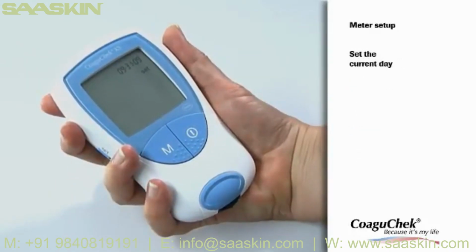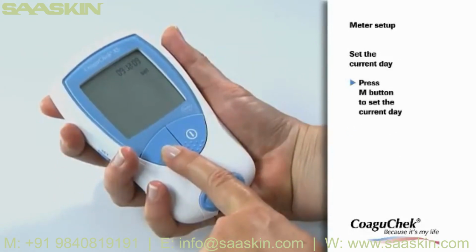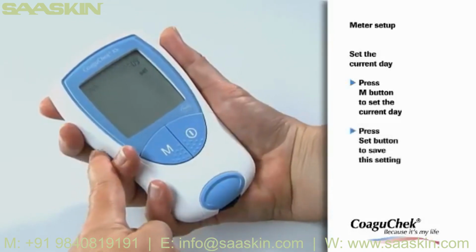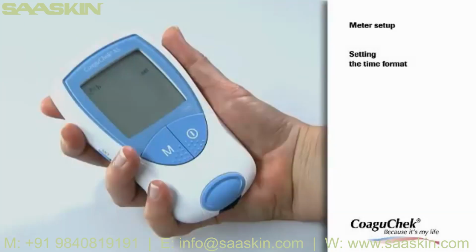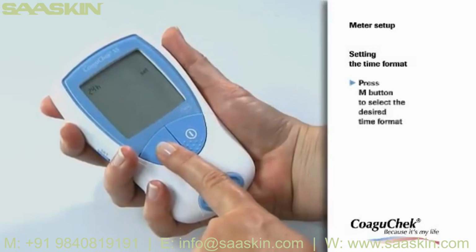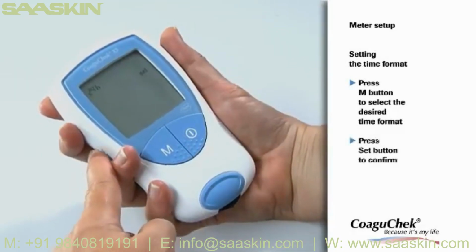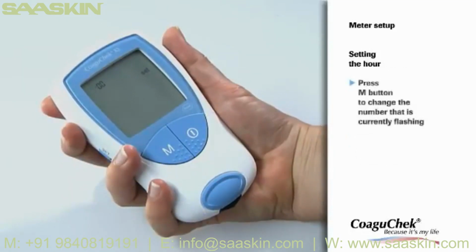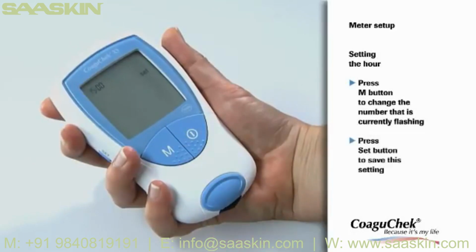The final step is to set the current day. Press the M button to change the flashing number until the correct day is displayed, and once again, save the correct day by pressing the Set button. The display now changes automatically to the time format setting. Just press the Set button to confirm the desired format. Accordingly, the display changes to the time setting. First, press the M button to change the hours and save your setting.